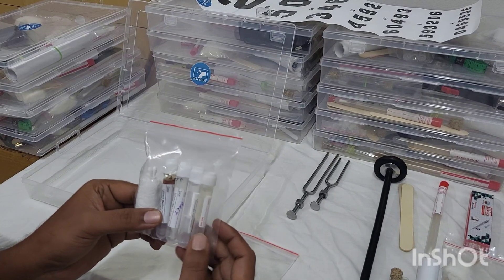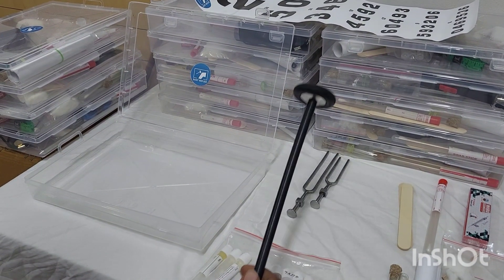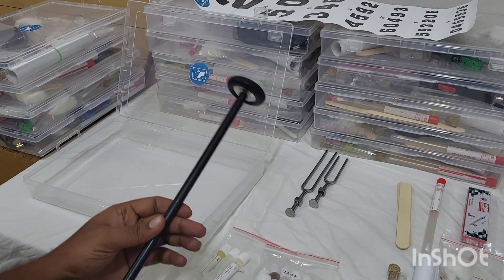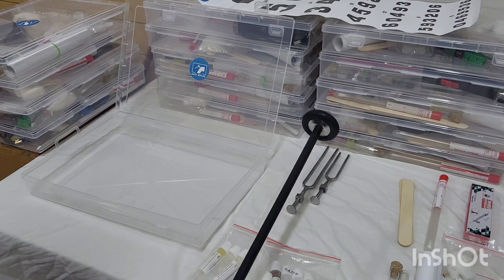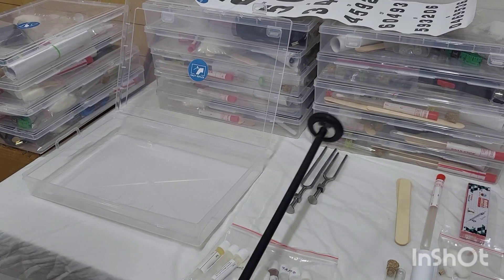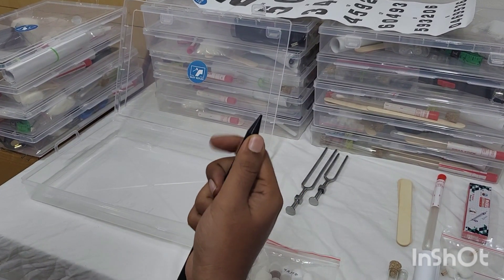Next we have our pro reflex hammer, which is an excellent heavy-weight reflex hammer around 135 grams, so it will be very easy for you to elicit reflexes. Even ankle reflex comes very easily, and it is easy to do a Babinski with the help of a short pointed edge.